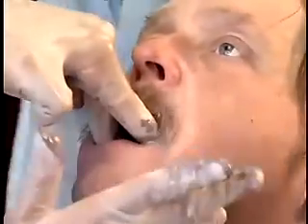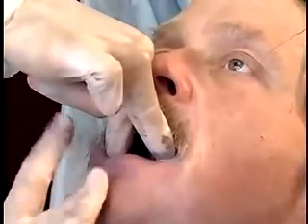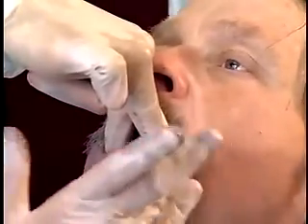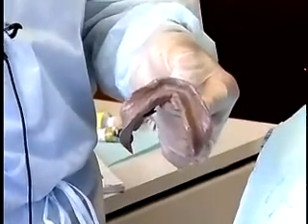Hold it in position with the index and forefinger with enough pressure to keep the tray seated. The vestibular tissues may be briefly and lightly border molded for about 30 seconds after the tray has been seated. Allow the material to set. Remove the final impression. Inspect the impression to determine if it's acceptable.